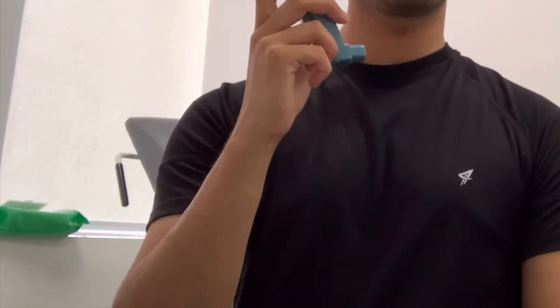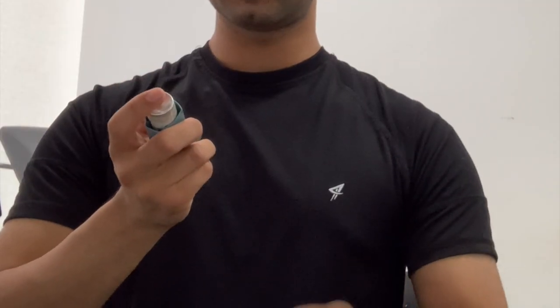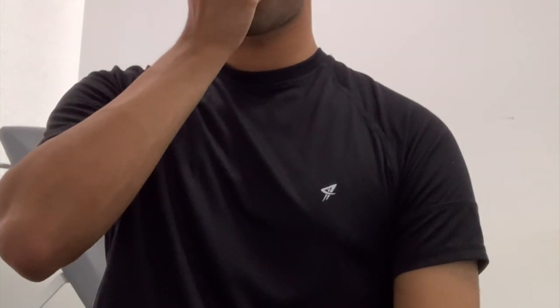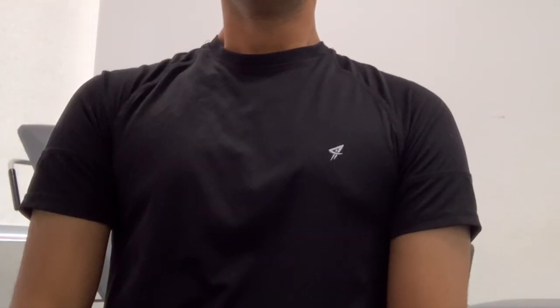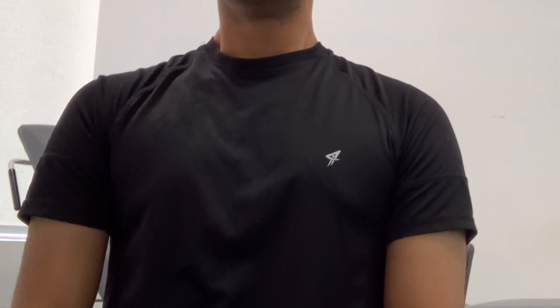Take the cap off, look away, take a deep breath out, make a tight seal, and take a deep breath in and hold for 10 seconds. And breathe back out.